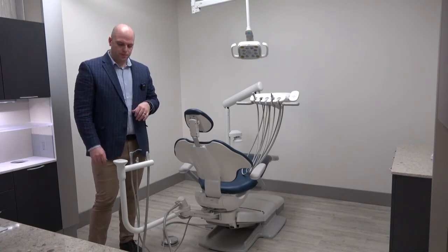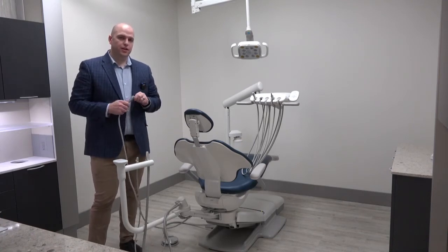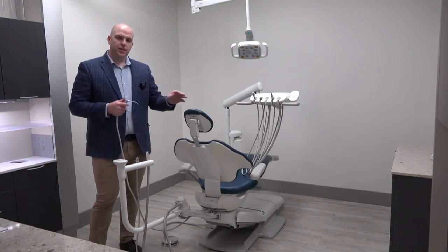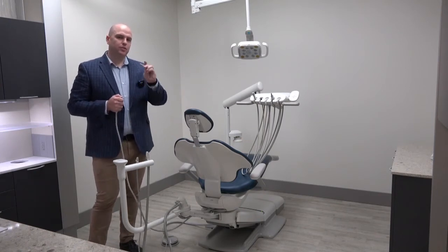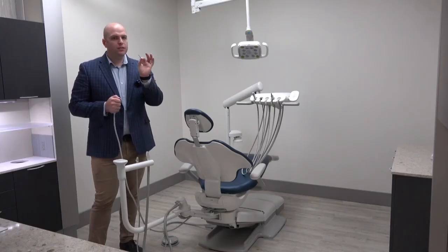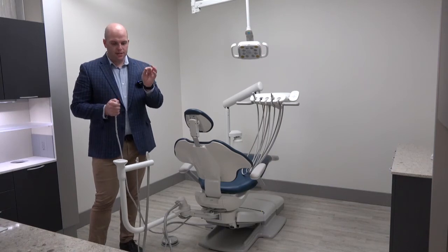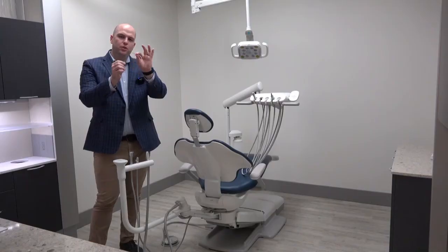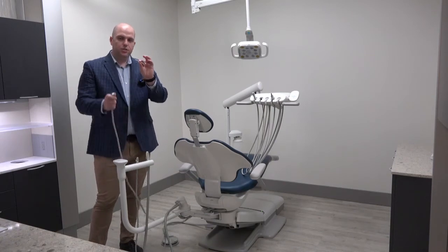Next, let's take a look at the syringes. There are two syringes in the operatory: one on the assistance arm and one on the unit. Each package should come with a pack of A-dec autoclavable syringe tips. Our syringe tips are designed differently than other brands — on the back of the syringe you'll notice there are three ridges.